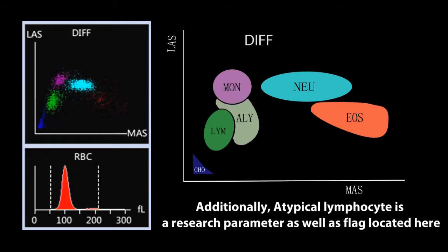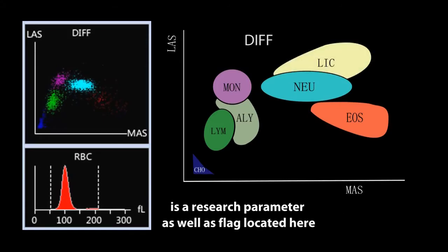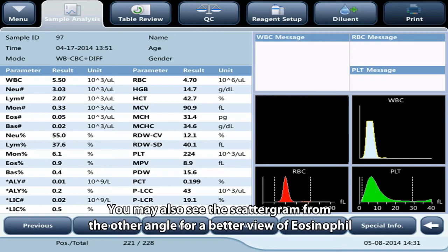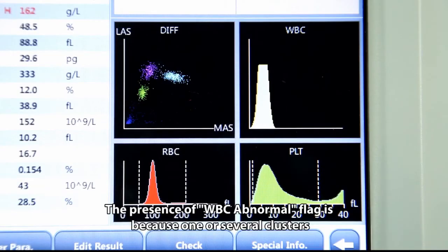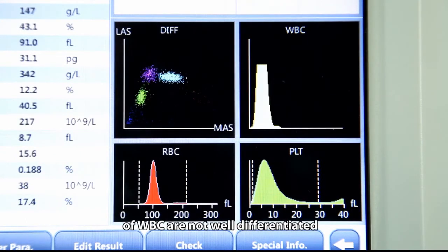The DIFF scattergram gives lymphocyte, monocyte, neutrophil, and eosinophil results. Additionally, atypical lymphocyte is a research parameter and flag. Large immature cells including promyelocyte, myelocyte, and metamyelocyte are also a research parameter and flag. NRBC is a flag as well. You may view the scattergram from another angle for a better view of eosinophils. The presence of a WBC abnormal flag means one or several WBC clusters are not well differentiated.